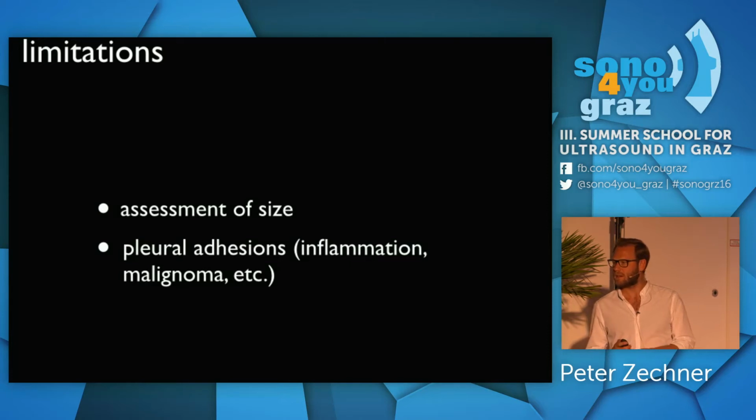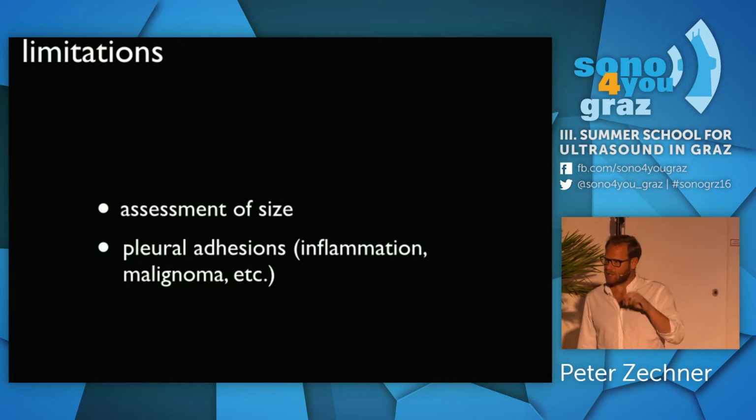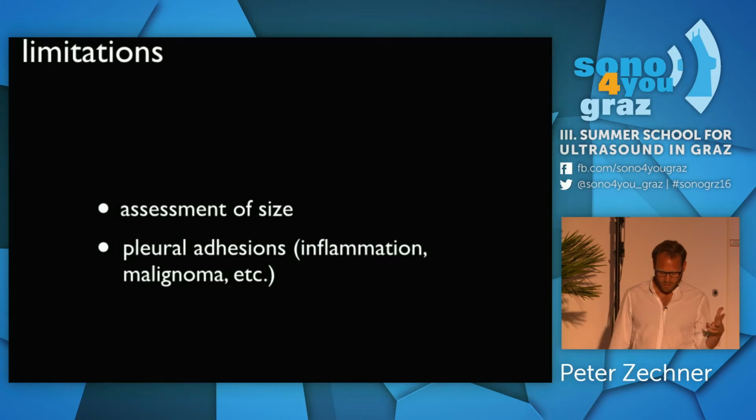Yes? So for our colleagues in Germany, just a repetition of the question. The question was, how do we find the lung point?